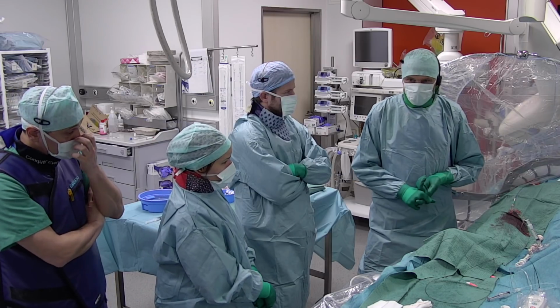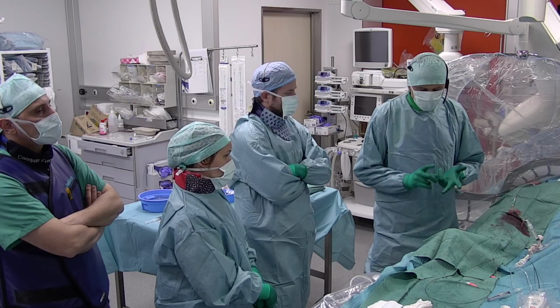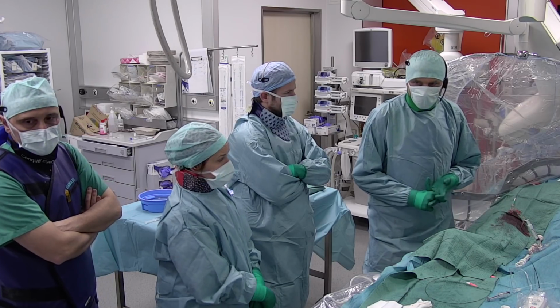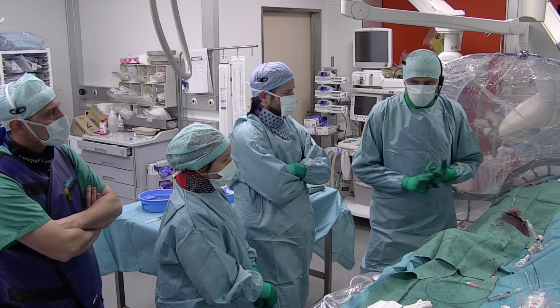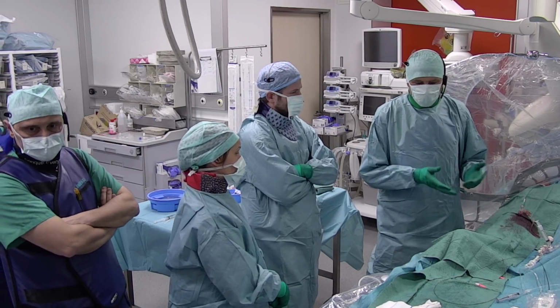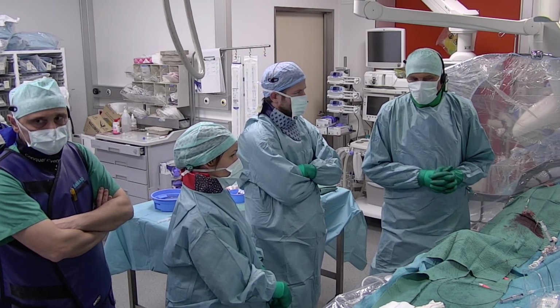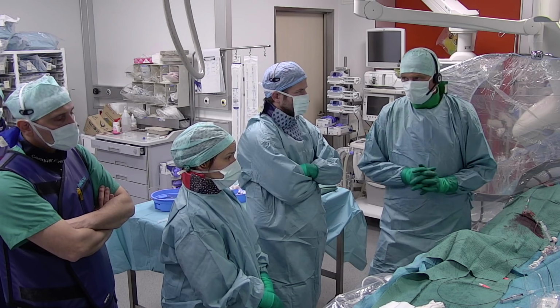Or we do IVUS, that's probably still a good choice for the left main. Or we do OCT.